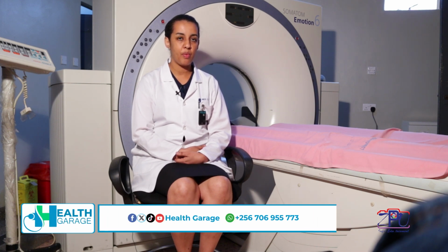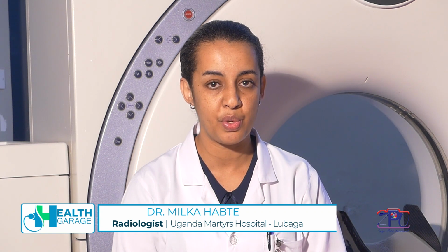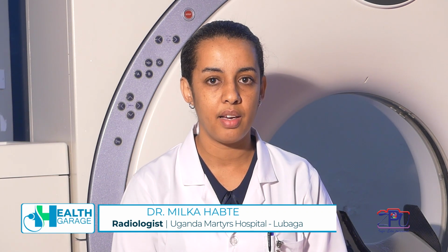However, we have some restrictions in using it on children, unless it's mandatory to use a CT scanner. We look for other imaging modalities for children, pediatric age group, because of the radiation. CT is used in all age groups. A CT scan is done following a request from a clinician.